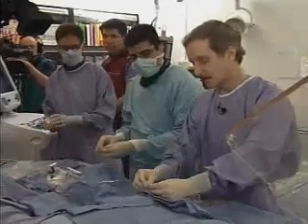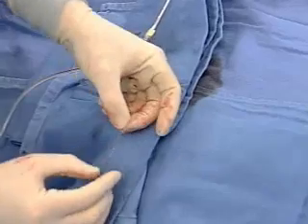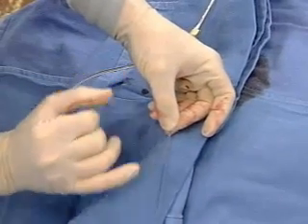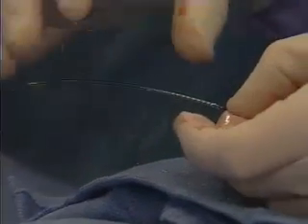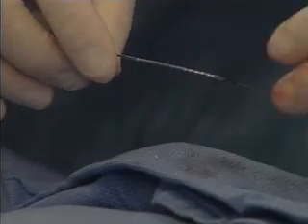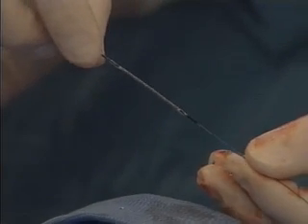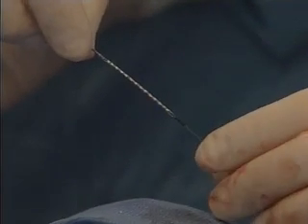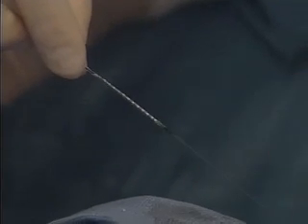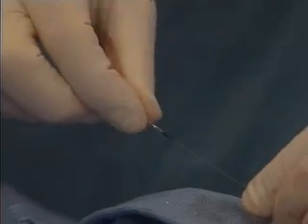The stent is now mounted on the wire. You can see the stent goes from here to here. It's in its obviously collapsed stage. A balloon sits inside the stent. That's a nice picture of it. The technology is unbelievable, considering the size of the stents and the strut structure. So now I'm going to advance the stent down the wire.